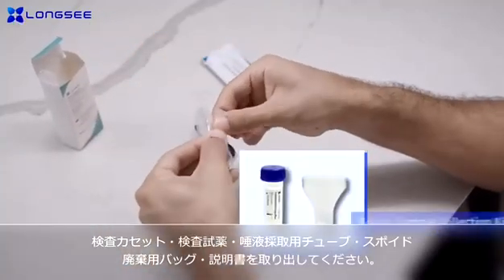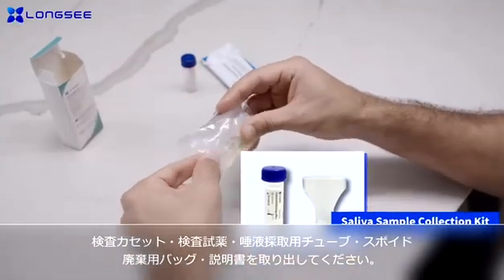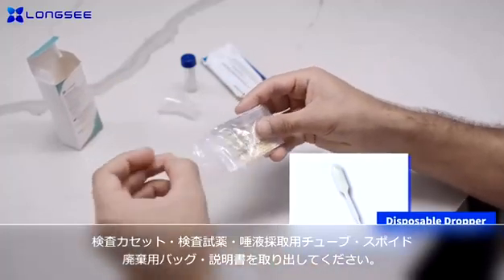The kit includes the instructions, saliva sample collection kit, 2019 NCOV-AG Rapid Detection Kit test cartridge, and specimen bag.